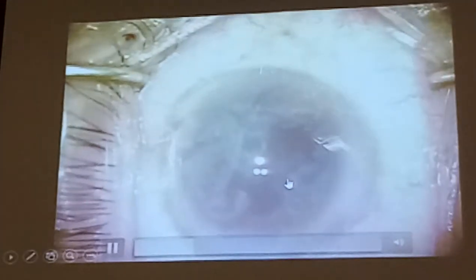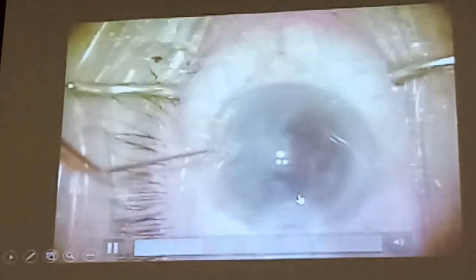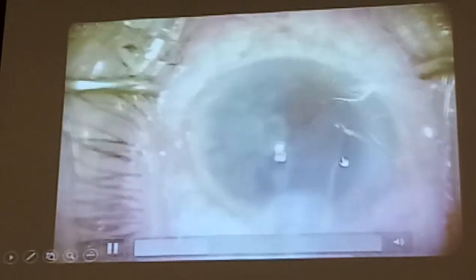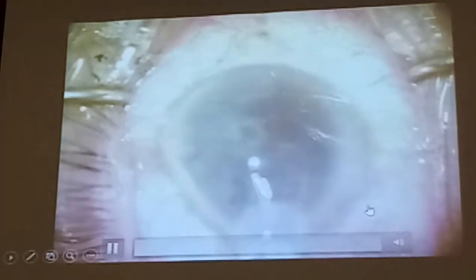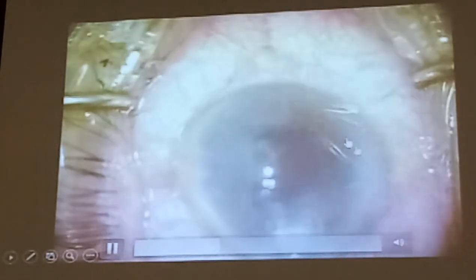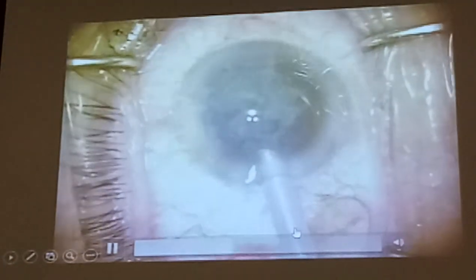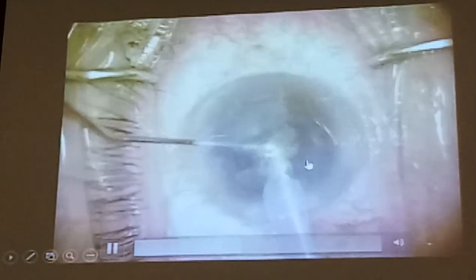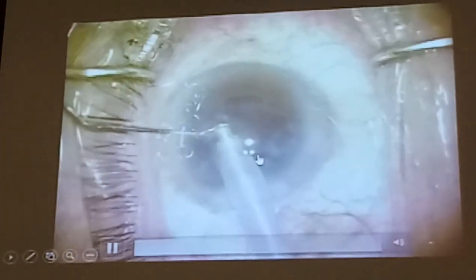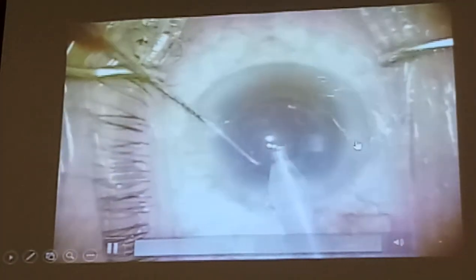Now I've got a space, a clearing — not much vitreous behind. I'm putting in the three-piece IOL, which is going to act as a scaffold. Because I was not there earlier, I didn't see exactly what the situation was behind — I don't know whether the lens can go into the capsular bag. So I'm just going to put the lens into what could be the anterior chamber or sulcus. I know there's an anterior capsule there, but I'm not sure about the rest. If you put the IOL in the anterior chamber to act as a scaffold, you'll find the chamber is shallower, so you need to really slow down your parameters when you do the phaco — because you're quite near the cornea and you want to be gentle, respecting the endothelium.